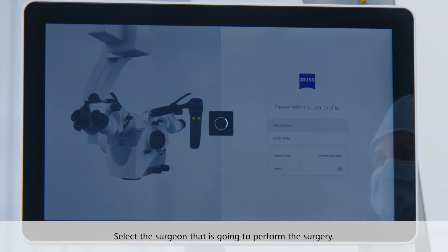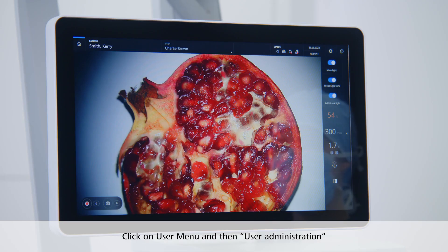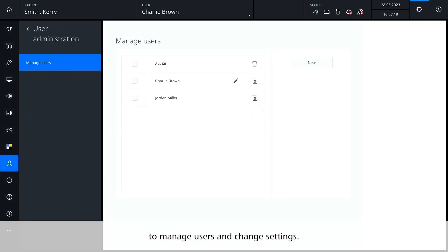Select the surgeon that is going to perform the surgery to load their settings. By clicking on the user menu, you can change the user. Click on user administration to manage users and change settings.